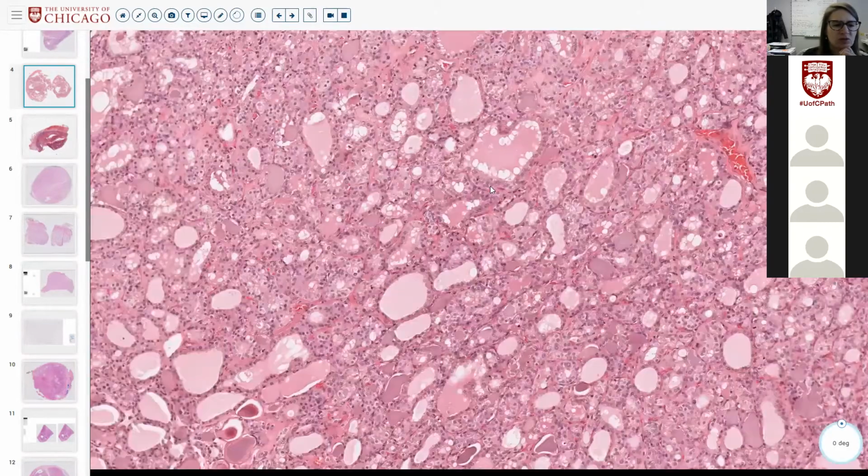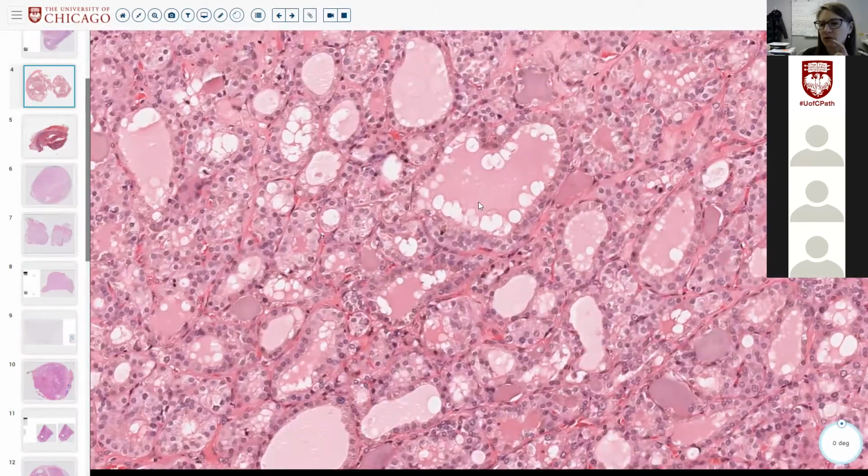In this case, just for the juniors, can you define scalloping? Yeah, so let me see if we can find it. Yeah, here, so it's when the colloid, the edges look like the scallop pattern in clothing. How about a scallop shell? Or yeah, a scallop. How about the shell scallop too? The pattern of a scallop? Something a little more easy to visualize.